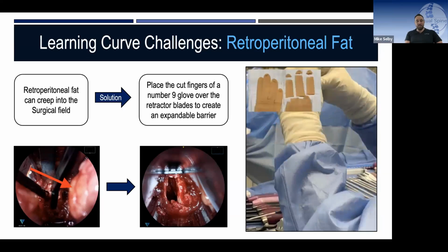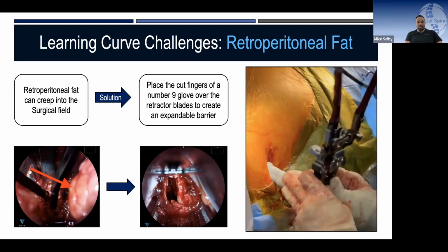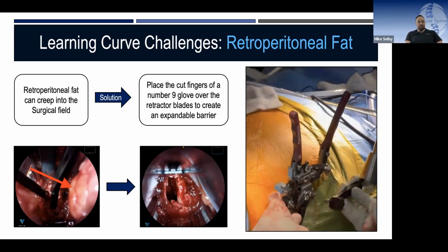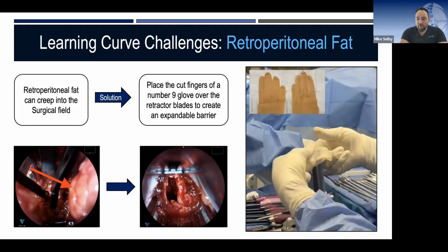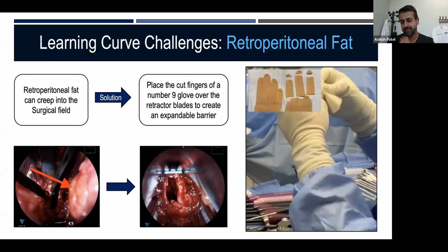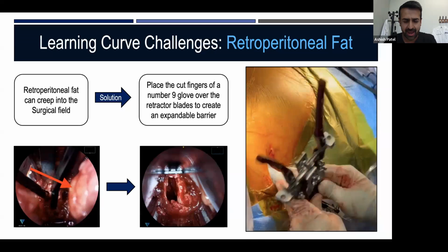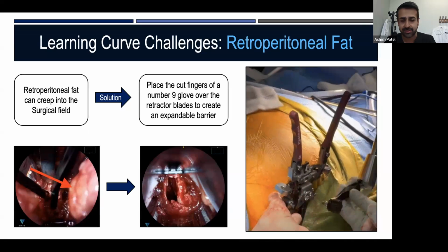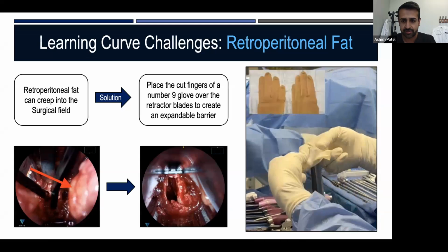Yeah, I agree. I think it's something that as this technique evolves, it'll probably come standard with kits, right? Instead of the innovators like yourself doing it sort of a MacGyver style, let's say. But yeah, I think getting some standardization is going to be good. I wouldn't do a prone lateral without it now, to be honest. Yes, exactly. And when I do see that bunch up happening, I'm spending the time taking that retractor out and putting the proper size glove on there. I've been burned by visualization where it's just not good.